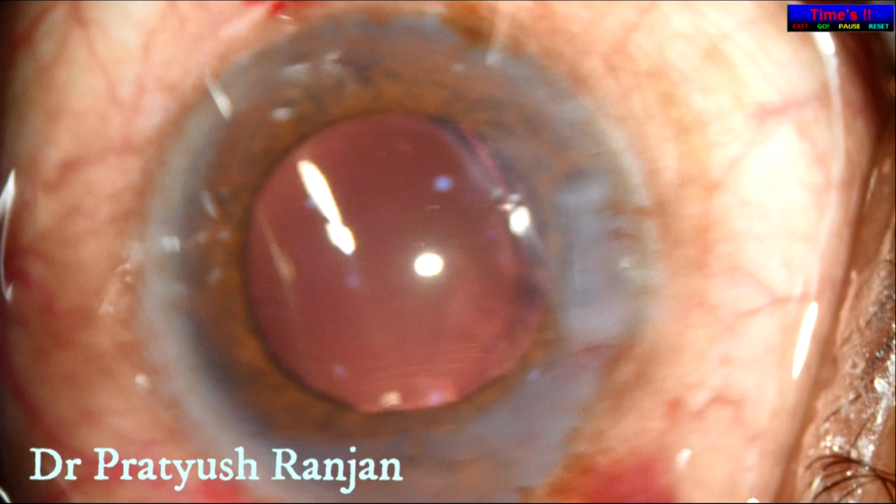But what are the advantages of doing a transconjunctival? First, it saves you limbal cells. Second, it saves cautery, and over-cautery can induce astigmatism and scleral melts. So it saves that time, and a little bit of bleeding actually helps in a good seal. A little bit of bleeding will cause such adhesions that bacteria won't enter.